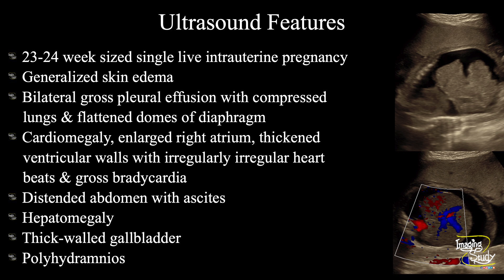In summary: a 23 to 24 week sized single live intrauterine pregnancy was seen. There was fetal generalized skin edema, bilateral gross pleural effusion with compressed lungs and flattened diaphragmatic domes. The heart was enlarged with enlarged right atrium, thickened ventricular walls, irregularly irregular cardiac pulsation, and gross fetal bradycardia at the end of the scan. There was a distended abdomen with ascites, hepatomegaly, thickened gallbladder wall, and polyhydramnios. Combining all these features, this is a case of fetal hydrops with cardiac failure.